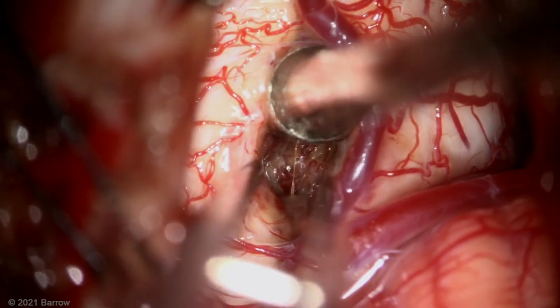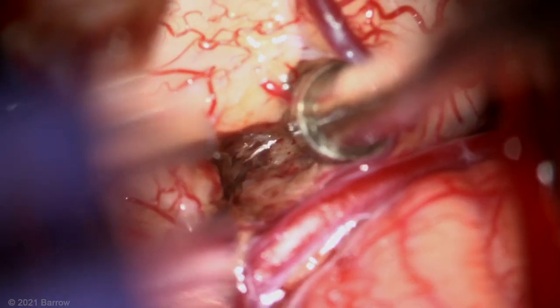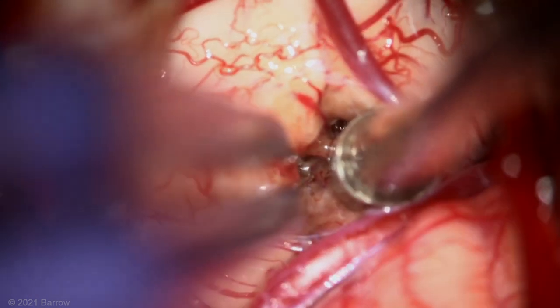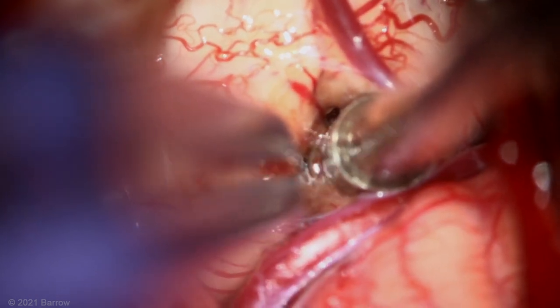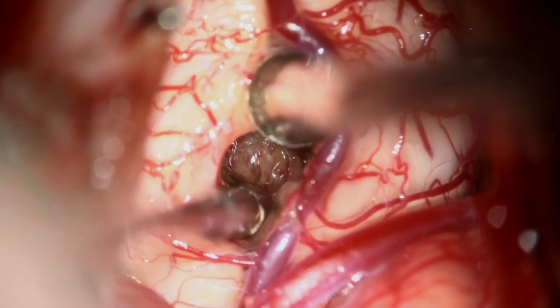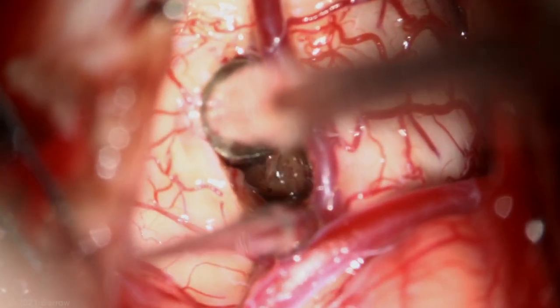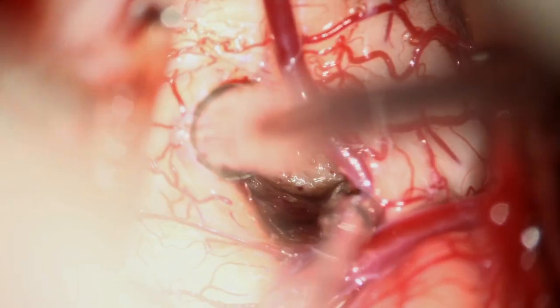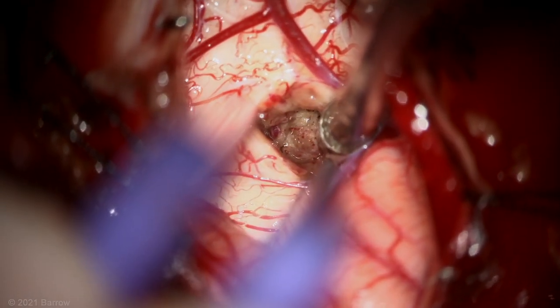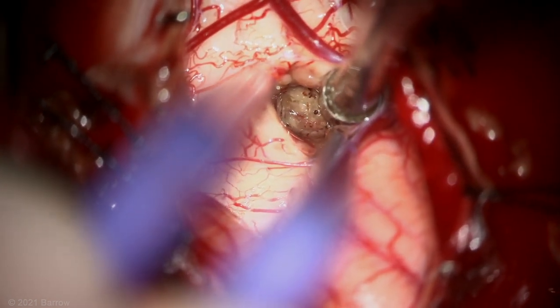I like to take these out en bloc, but as you can see with this case, this needed to come out piecemeal. As the resection nears its end, there are still a lot of these little blebs of malformation — almost like the little druplets of a berry that have been shed from the berry itself — and you can see these little spots in the gliotic margin. These are like seeds that require some meticulous removal.